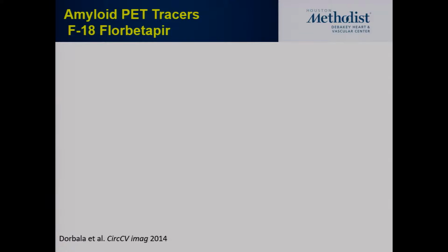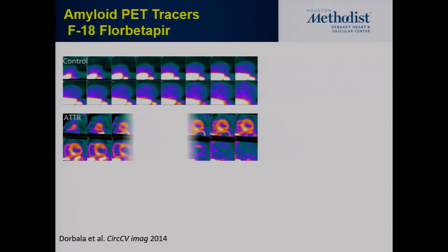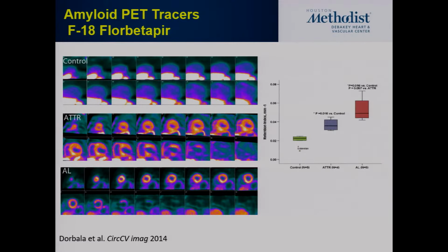There is a lot of hope for PET tracers that are currently being studied to look for that. And these PET tracers may change with time. We'll soon start a trial here using one of these tracers that could potentially be used to assess response to therapy. Similar to FDG in PET, it's an F18 agent, and it has good data. At least the data is currently being gathered to look at potential response to therapy.